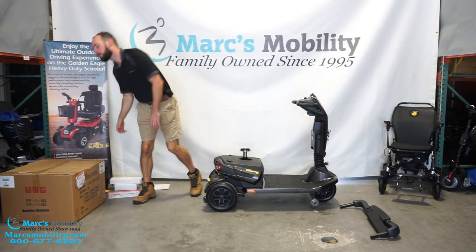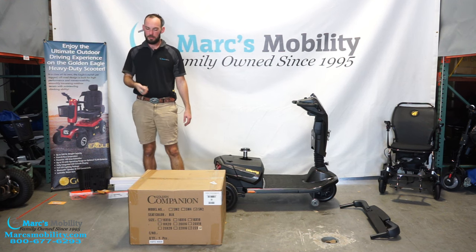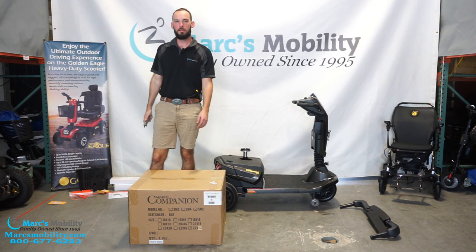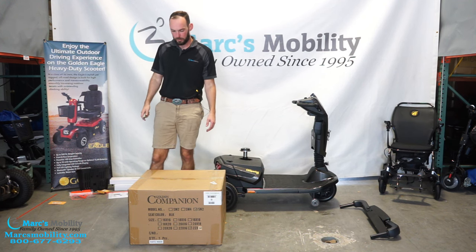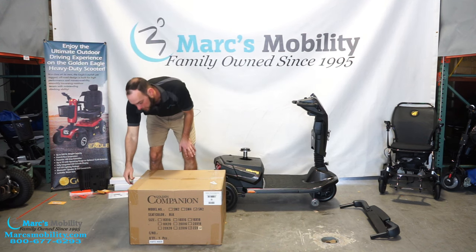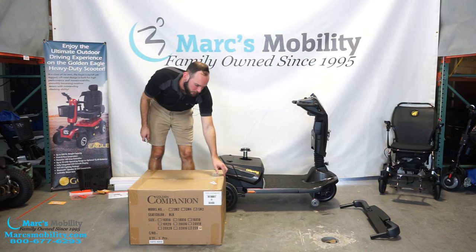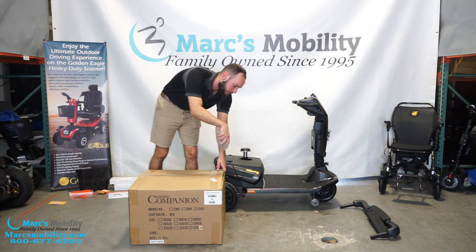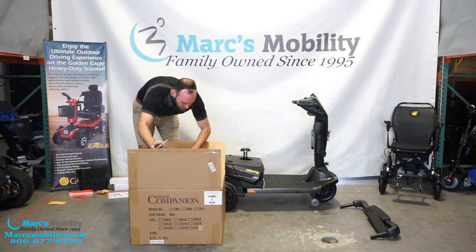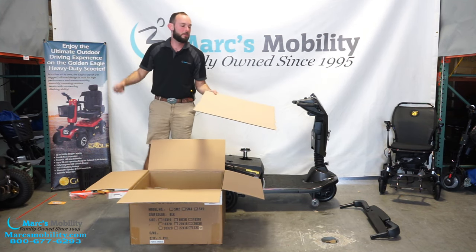Now it's time to unbox our seat. We're going to grab our seat box and cut it with a knife — be very careful. Do not cut down into your seat; we don't want you to damage it, as that's not covered under warranty. I recommend cutting the sides first because there is tape holding the box in. Once the sides are cut, lift the two flaps up so that when you cut down, you're not going to hit into anything. There is a protective layer of cardboard underneath, but still exercise caution.